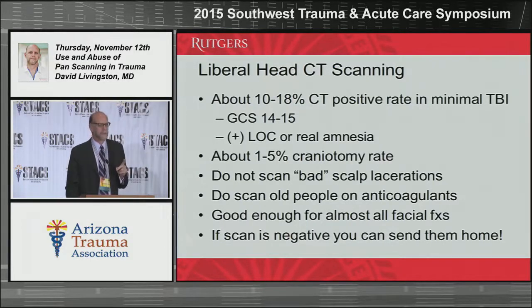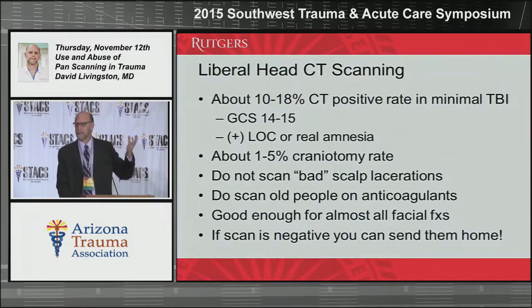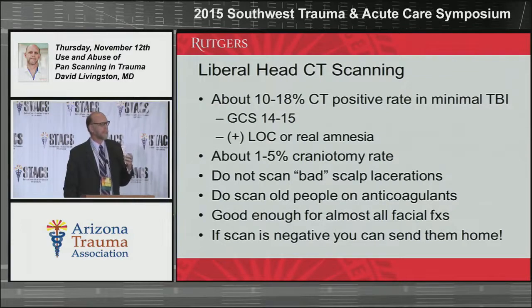But more importantly, what happens is we always think about the positive, the scan that's positive. What about the scan that's negative? Well, the scan that's negative is pretty good. Because the negative scan, and we'll talk a little bit, I got questions when I gave this once before about anticoagulated patients, but if you're not anticoagulated and your head CT is negative, and that's all you have, you can send these people home.